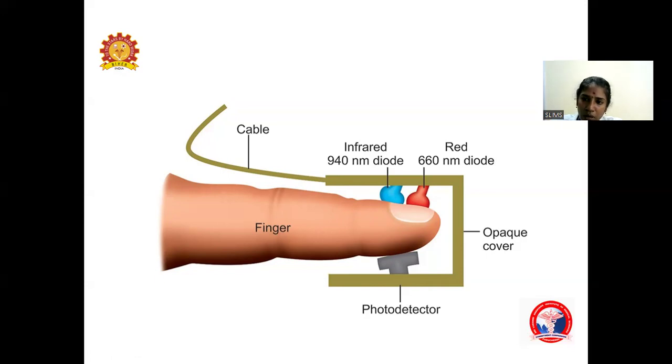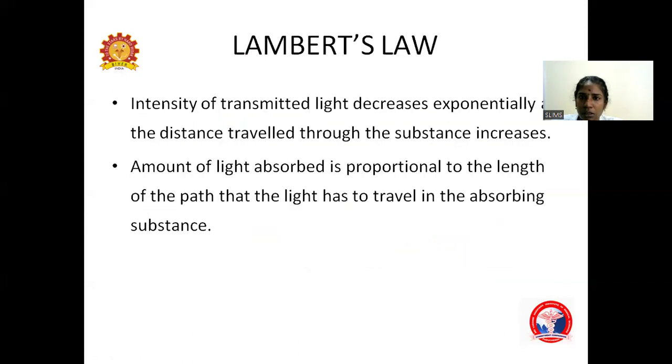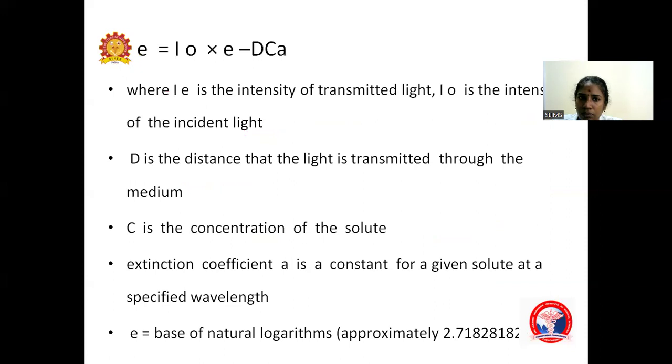And what is the formula to calculate it? Can someone tell the formula? Yes, I equals I0 times e to the power minus DCA.